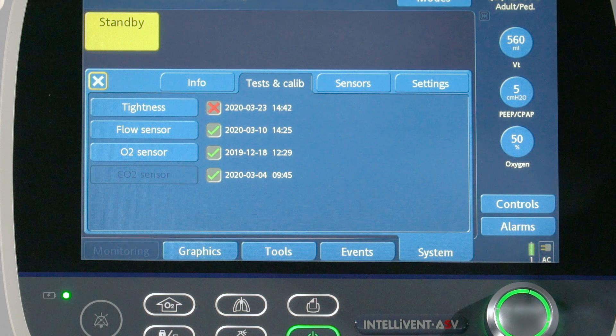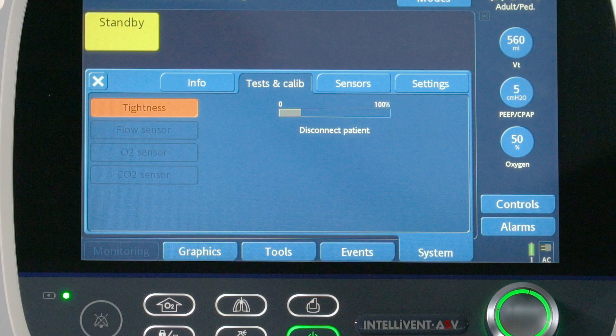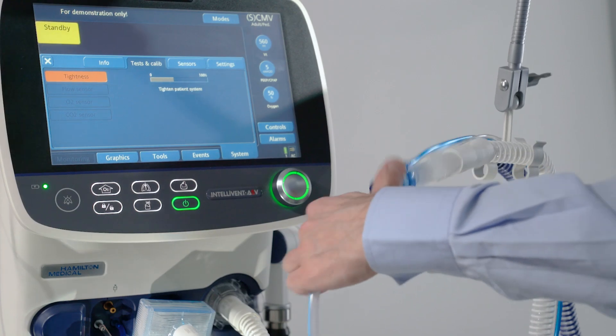A green check mark indicates the component is calibrated and ready, while a red X indicates the last calibration was unsuccessful. A box with no marks indicates the test or calibration has not been performed. If the CO2 sensor is not enabled, the box will be grayed out.